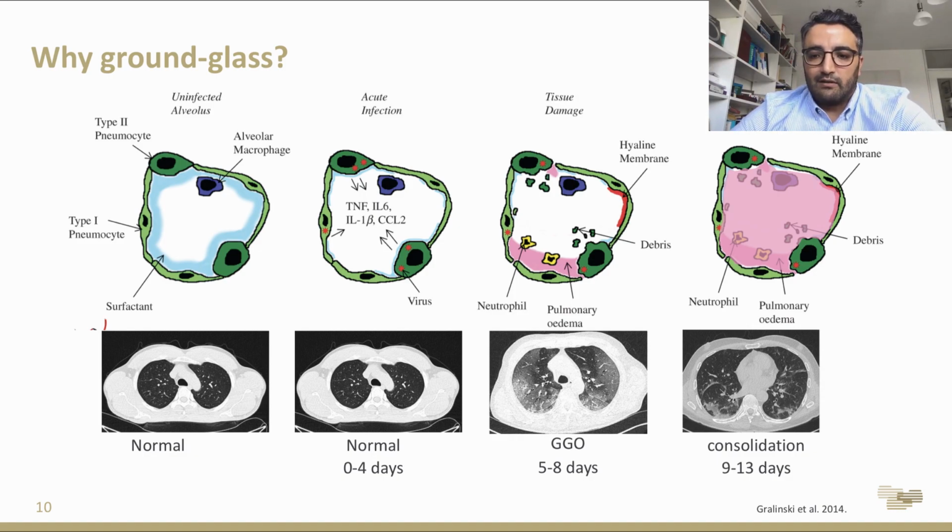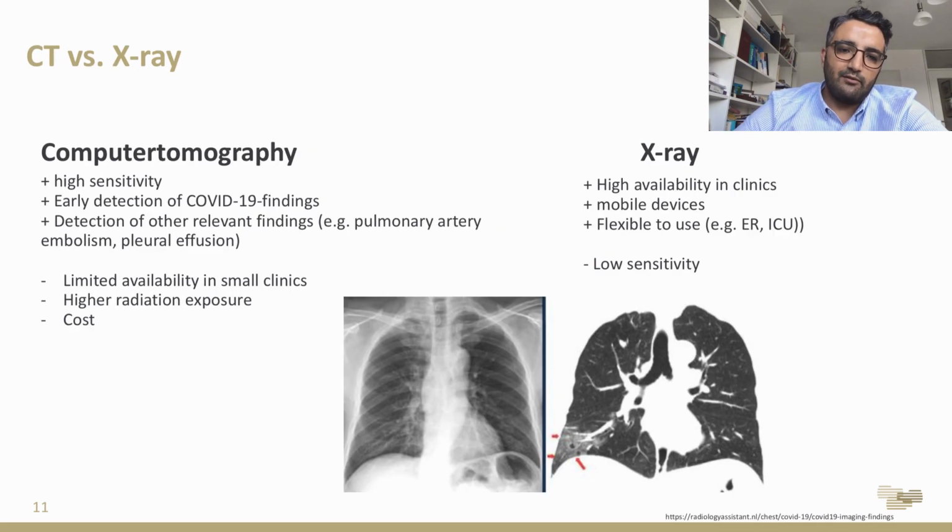And the more it gets filled, then it will change to consolidation after a while. I noticed maybe for some a little bit boring, but it is very important sometimes to understand the link between the pathophysiology and the image, why we are seeing it white, so we can understand it is the edema what we are seeing, and not very specific, not the virus we are seeing.